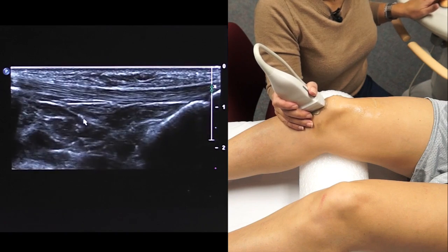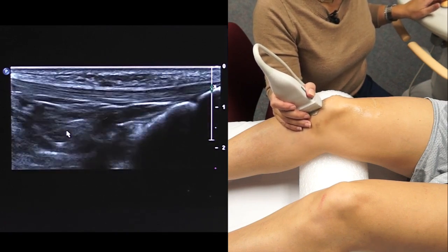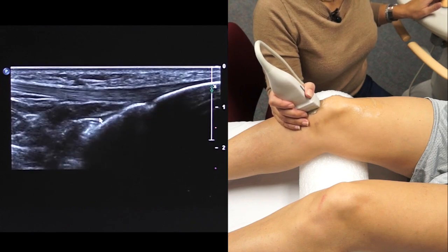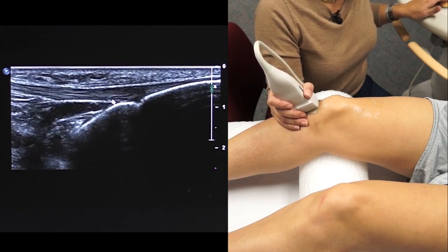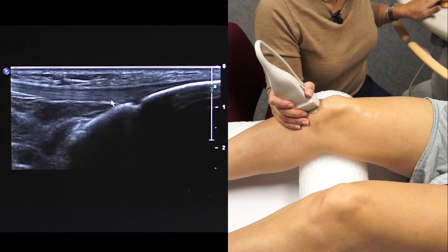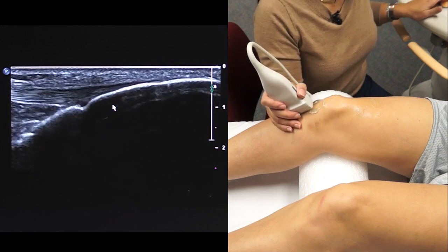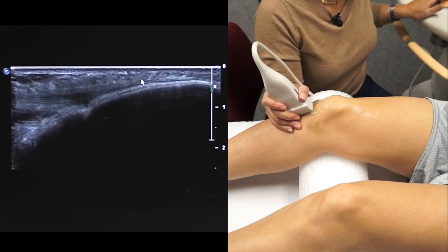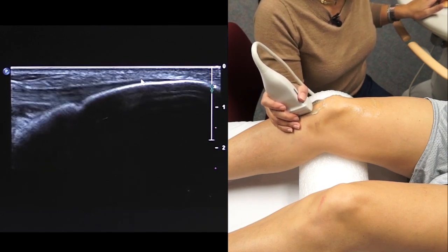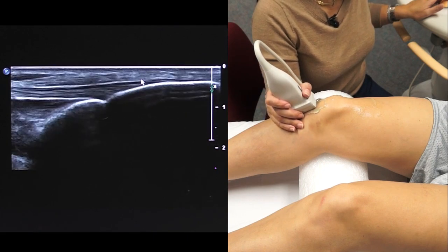Now, deep to the patellar tendon is fat. This is called Hoffa's fat. And there are regional bursa in this area. You can have superficial and deep bursa. And one thing to point out is that when you are looking at very superficial structures, if you are scanning with a heavy hand, you may compress bursa or distended bursa that are in that area.